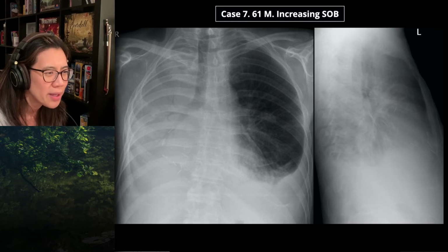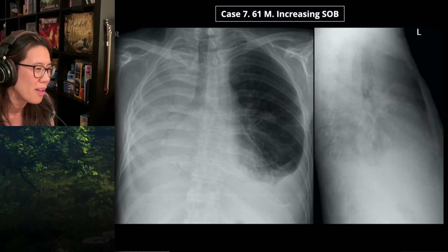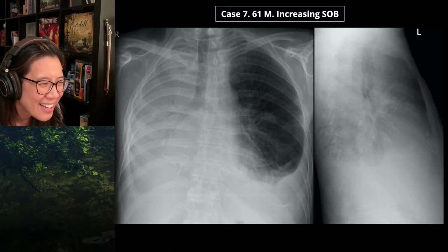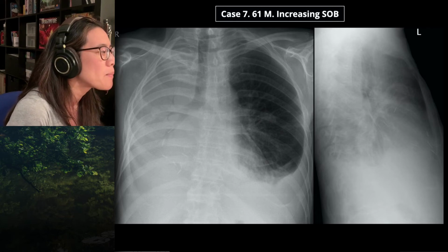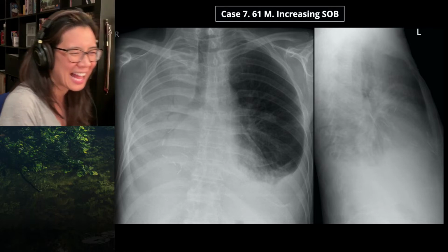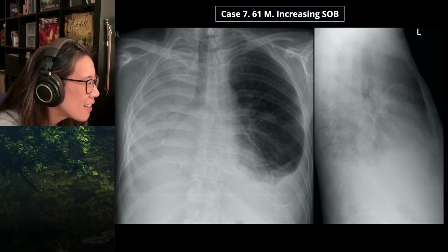Now, I'm just looking at the lateral, and I think I'm seeing something ovoid in the infrahilar region, but I'm not sure if I'm making it up. I would ignore it. There's no aerated lung on the right other than those air bronchograms, so whatever you're seeing is probably on the left. No, ignore the left. There's a left pleural fluid. I want you to tell me what you think is going on on the right.